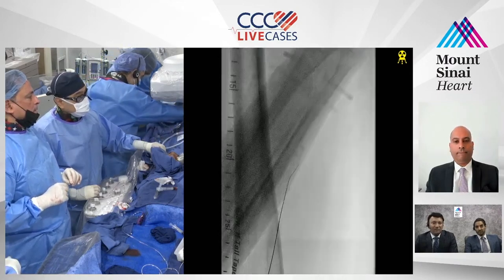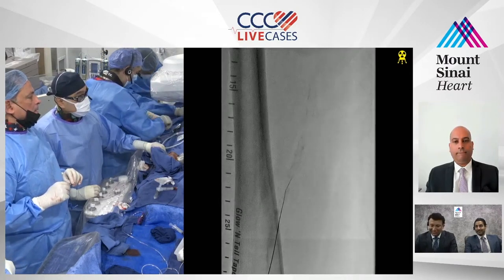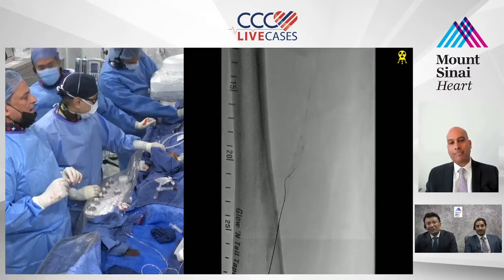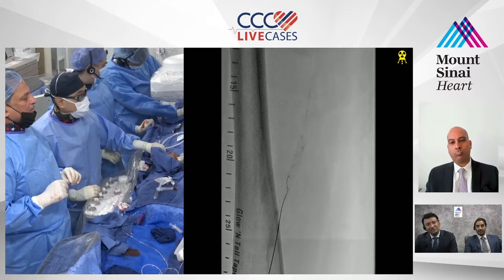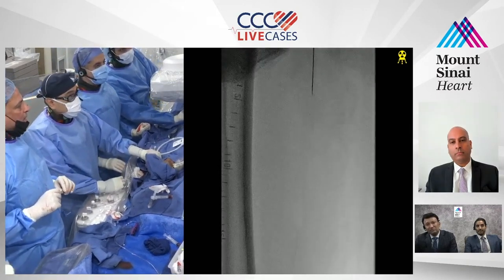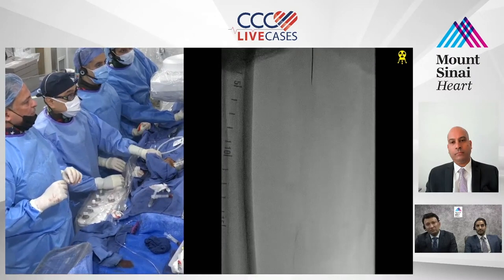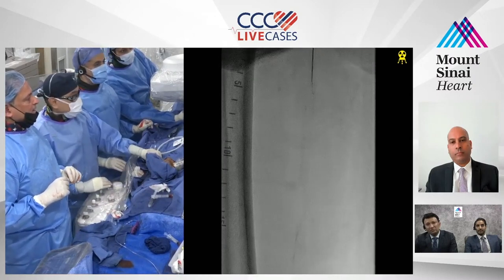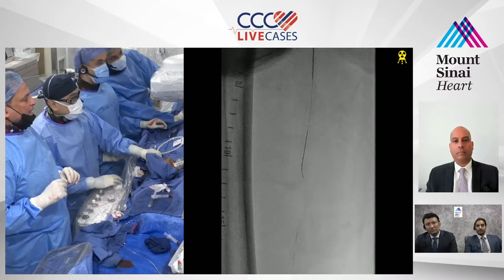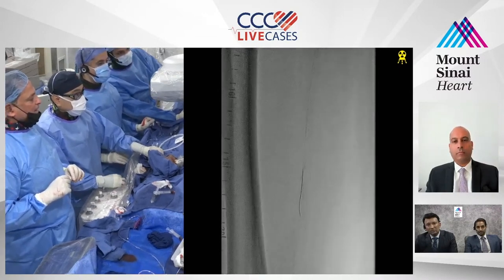Or lose a single axis. Well, you know, guys, it's a challenge. It's a lot of difficult choices. Part of what we're trying to show is where we are in terms of our decision making of when we get pedal access. This is a lady who doesn't really have much option. So when we do pedal access in these kinds of patients, I think it's reasonable.